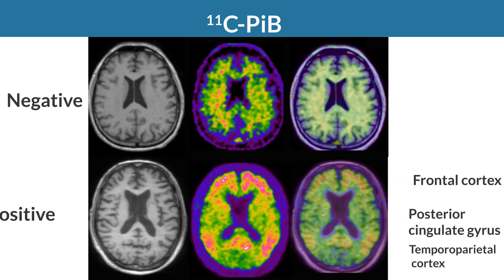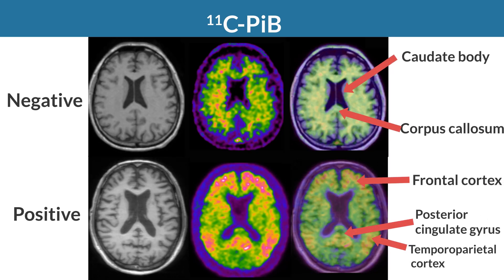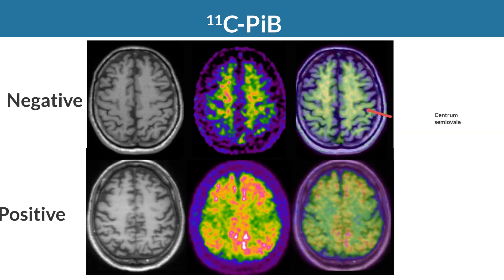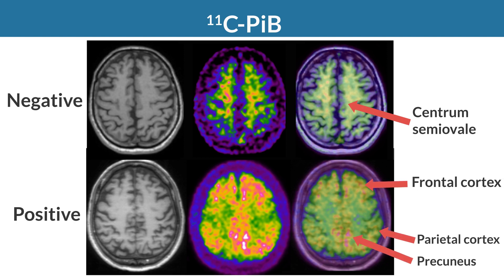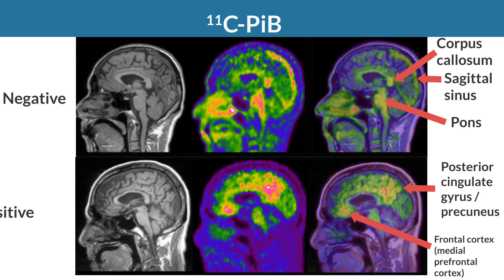At the lateral ventricular body level, posterior cingulate gyrus shows high accumulation in a positive case. At the centrum semiovale level, precuneus and parietal cortex show high accumulation in a positive case, while the pericentral sulcus area shows relatively low accumulation. In a mid-sagittal section, high accumulation is observed in medial frontal cortex and posterior cingulate gyrus and precuneus in a positive case.